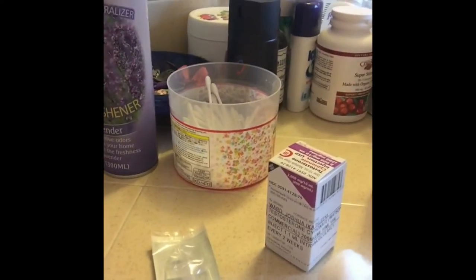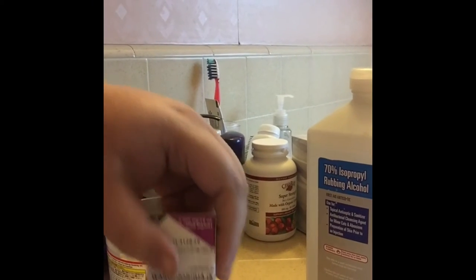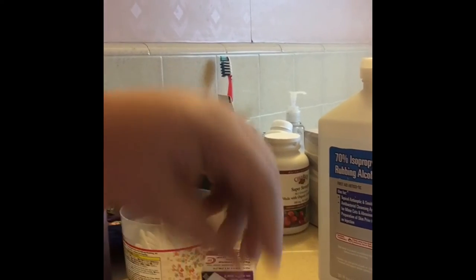First, here's the preparation. These are all of the items needed: alcohol, the testosterone itself, three cotton balls for sanitation and blood-stopping purposes, one band-aid, and one syringe.